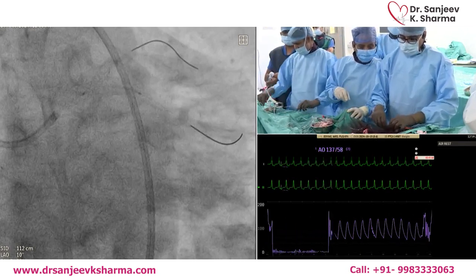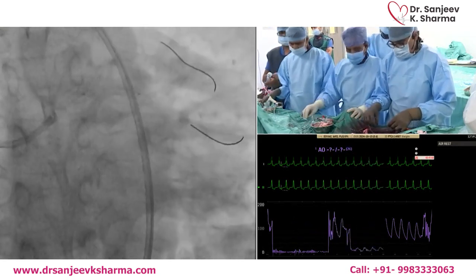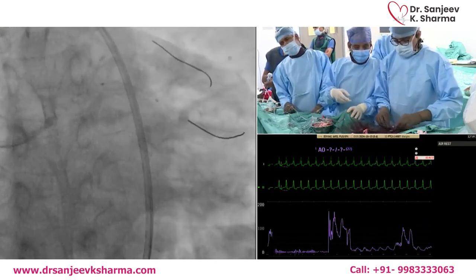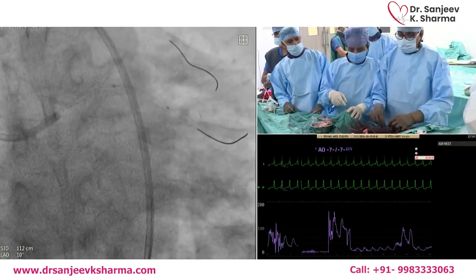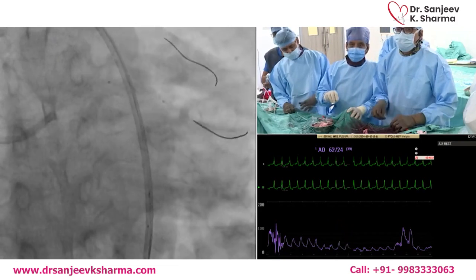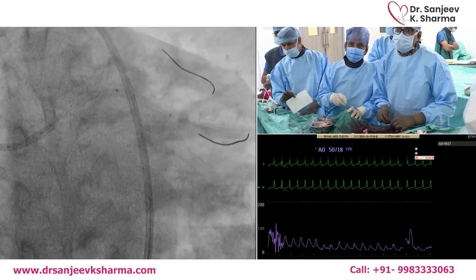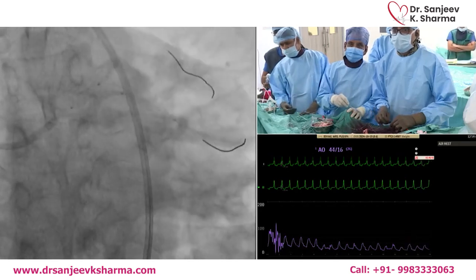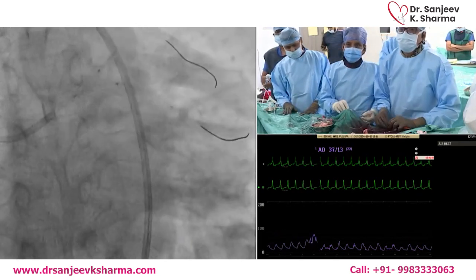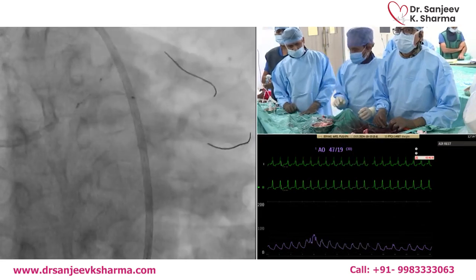But yes, when would you do the POT right away first? It would be if you cannot go to the side branch. But yes, people do it all the time. Is there any small chance of wire crossing by the side of the stent in the left main if the guide is not inside? No, initially, when we crossed to the circumflex, the guide was very much inside, very much coaxial. But you are right. That is one of the things people say, and therefore the technique should be that you put a wire into the LAD first and then come back and go to the circ. Yeah, let's go up.